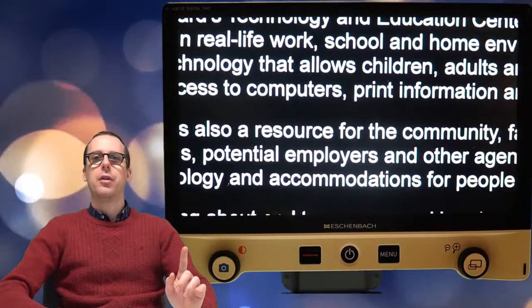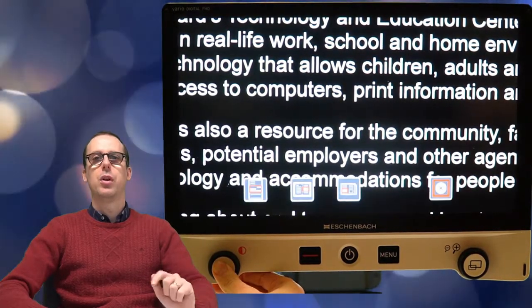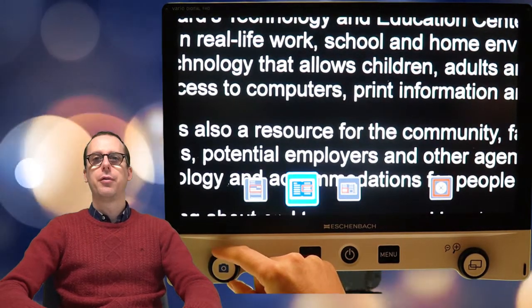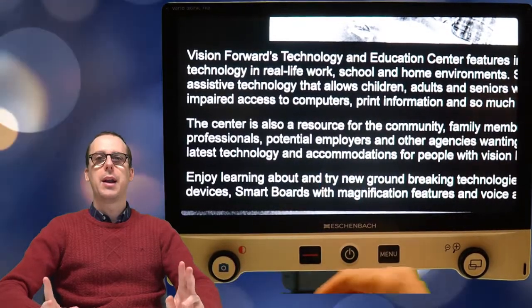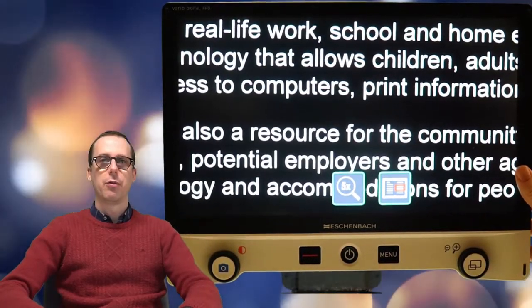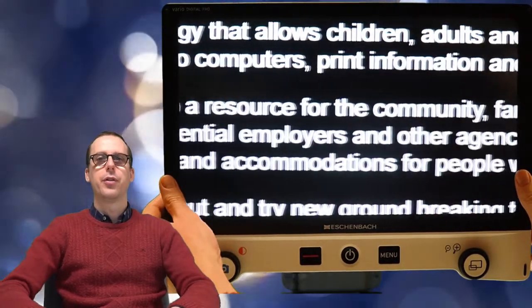So to choose one of those, you're going to hold the button in the middle of the color change dial. That's the same button that you would use to take a picture. You're going to hold that, and then you're going to select from 3 different reading modes. Once you've selected one of those, now those panning buttons on the side will be operational for panning up and down, left and right. I don't know why you have to do it like that. It seems needlessly complicated, but that's the way it is.